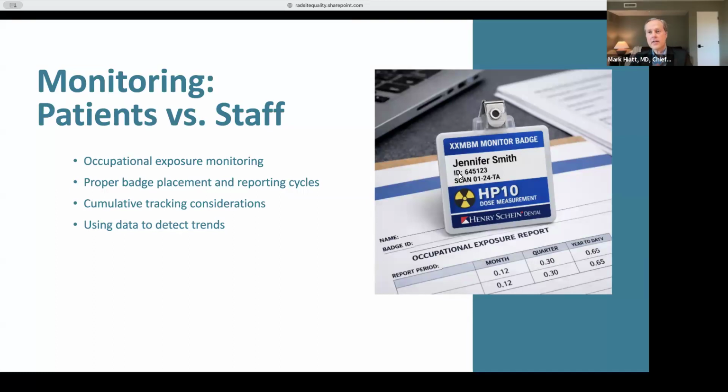And you're coming towards the end of the reporting period. You're concerned you may have been exposed too much. As you alluded to before, in your practice, you're increasing volume. So you should take that badge and just set it aside for the final days of that period so that you're in compliance. Always wear the dosimeter when you're in the room or in the area. It's very important to know. Thank you for that education, because I've seen these errors committed amongst various people.